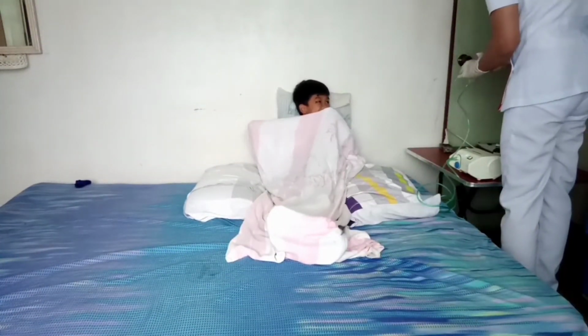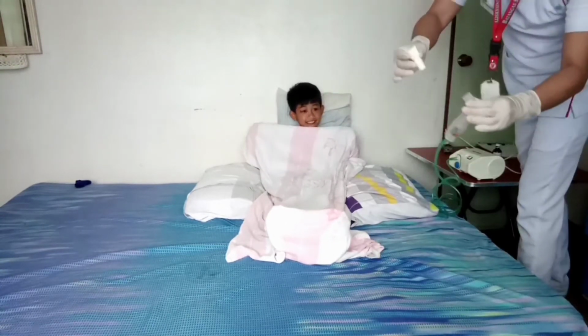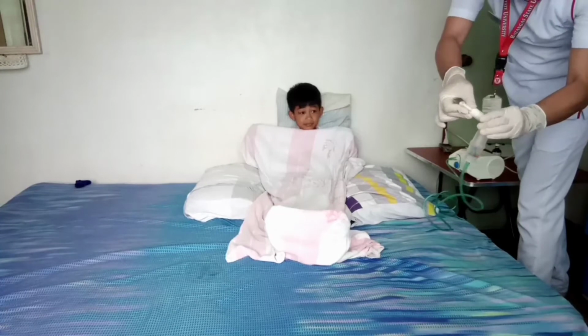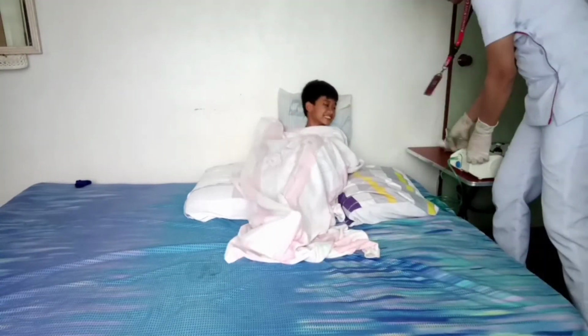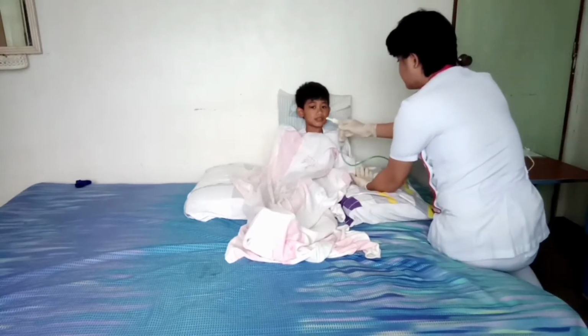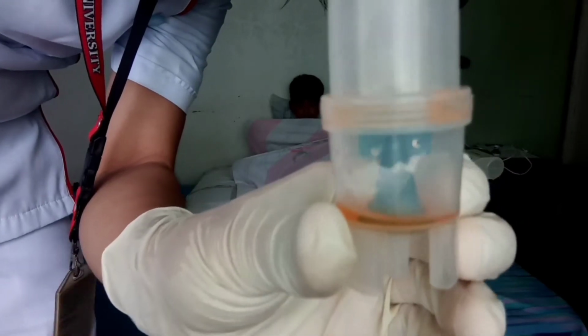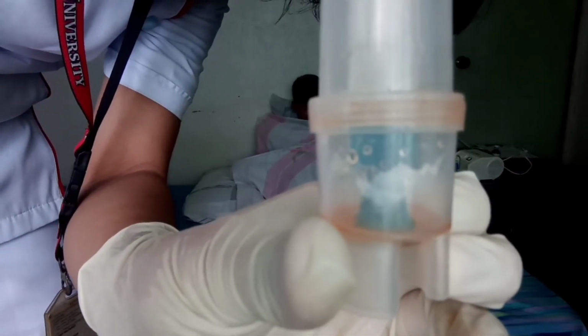And then connect the delivery device to the neb outlet. It is to ensure the proper delivery of the medication. Then turn on the neb machine, place the mouthpiece on the patient, and begin the neb treatment. A fine mist should be visible from the delivery device. This process verifies that the equipment is working properly.